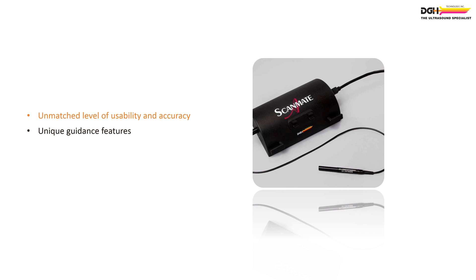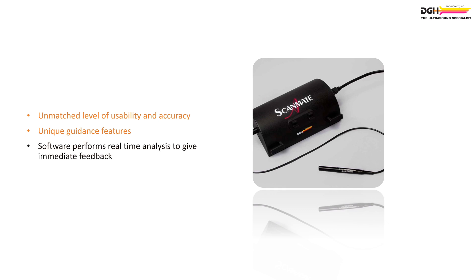These features allow the user to focus on application technique while the device's software performs real-time waveform analysis and provides immediate feedback to the user.